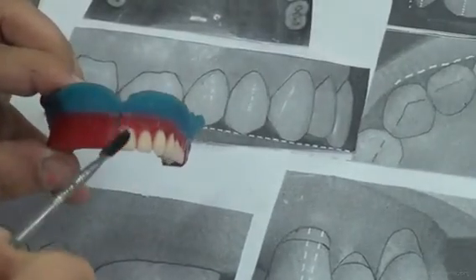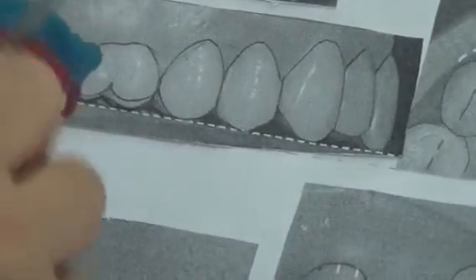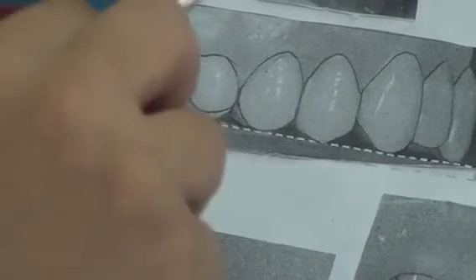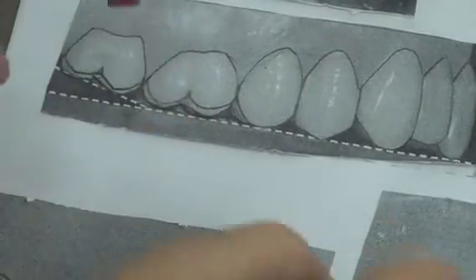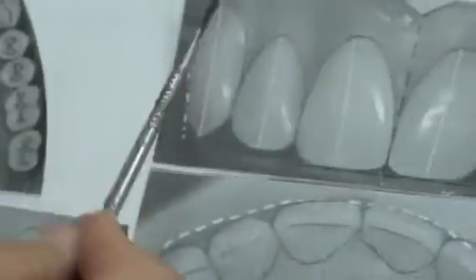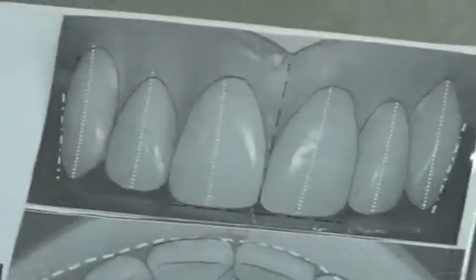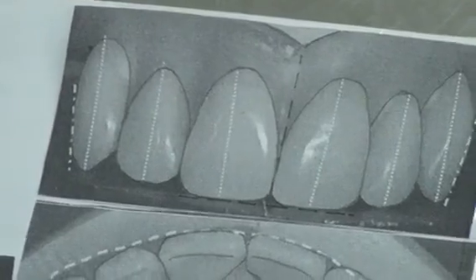So we depress the root of the central slightly. We depress the root of the lateral even more. We make the root of the canine up, and this is the canine upright. So the root is prominent. The lateral is depressed. The central is a bit prominent. So to produce what we call labial inclination.